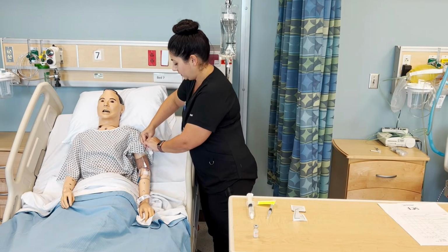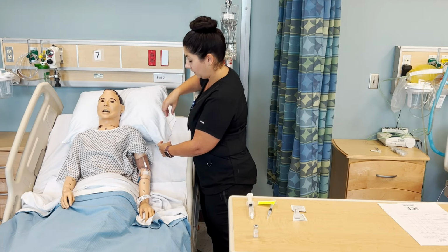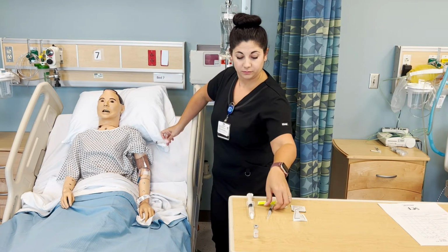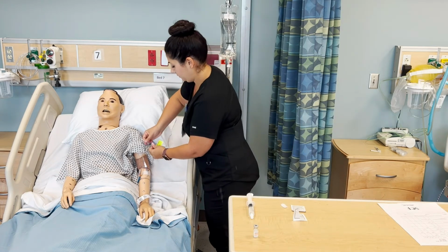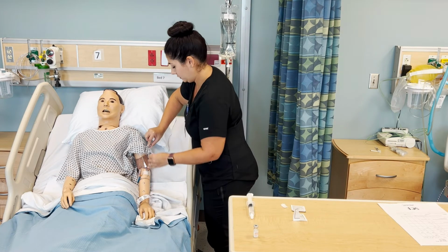Go ahead and flush with a full 10 milliliters. Slowly, but there's no time frame for this one. Then we'll switch to our medication syringe.